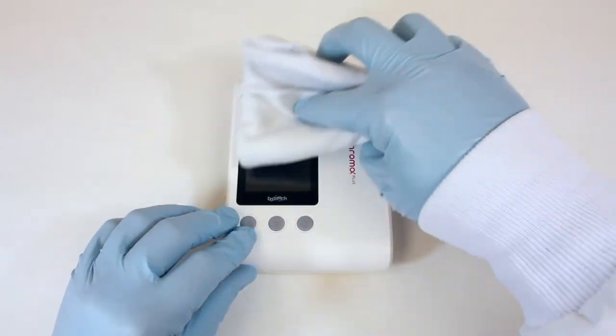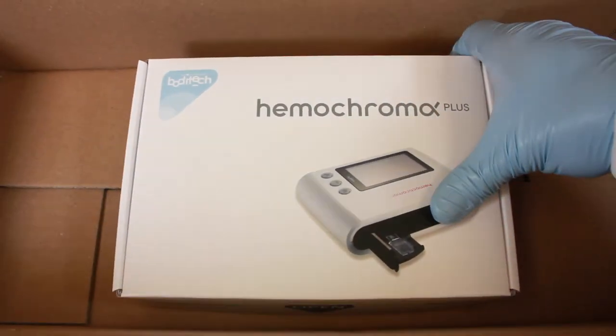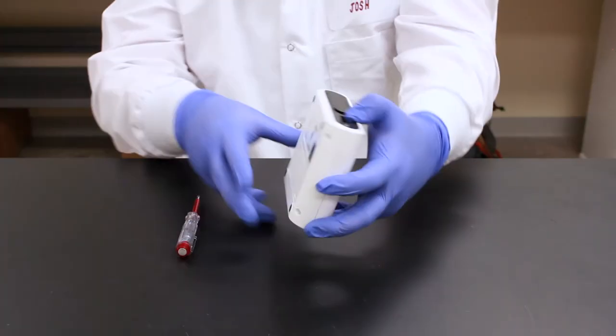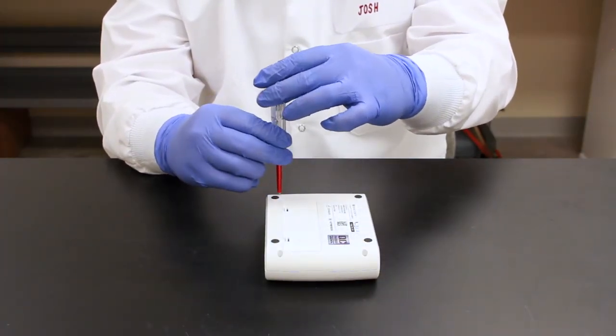Service for Hemochroma Plus Analyzer. No maintenance other than periodic cleaning and disinfecting is required for the analyzer. If it is determined by a technician that service or maintenance is required, a qualified service engineer will need to do service on your device upon it being returned for maintenance.